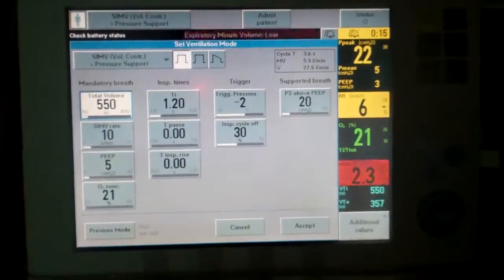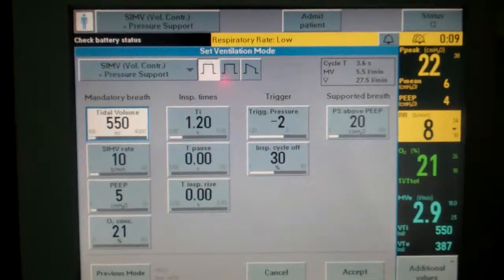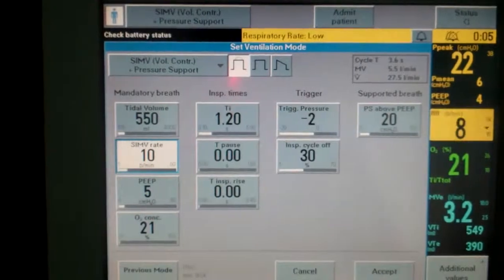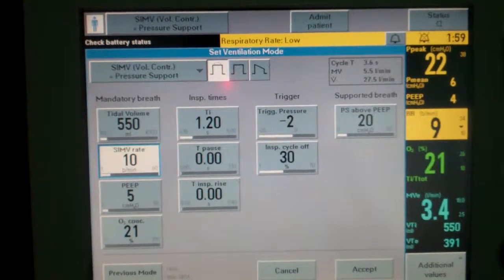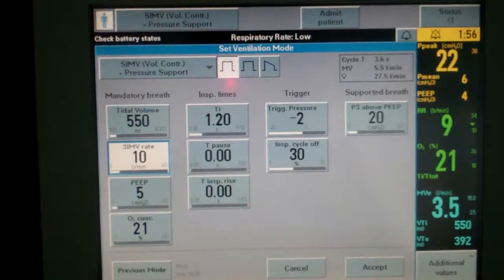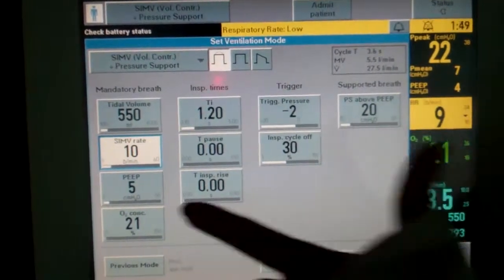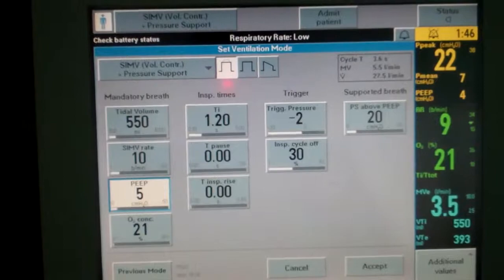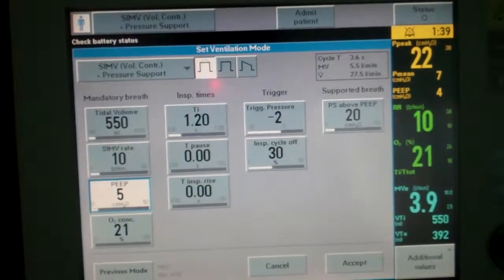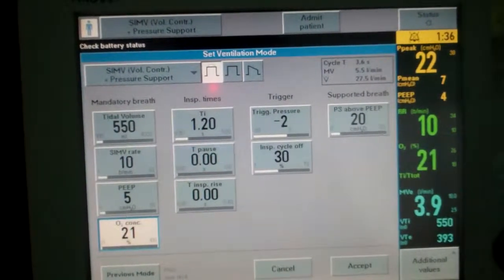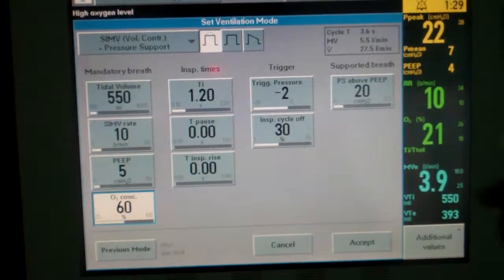The first thing we want to do is set a tidal volume. Usually we want this from 4 to 8 milliliters per kilogram — we will set this at 550. Next, you want a respiratory rate. We want a low respiratory rate, because if you set a high respiratory rate, the patient will not want to breathe spontaneously, and we need the patient to take spontaneous breaths along with their mandatory breaths. Next we have PEEP, usually set at 3 to 5, to compensate for loss of functional residual capacity. Here we will set our FiO2, usually starting at 100% and then titrating down once you assess the patient.